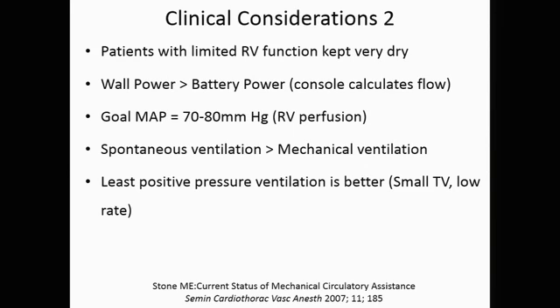Patients with an RV-limited circulation also tend to be kept very, very dry. So when you meet them and feel the urge to give anesthesia to them, it's appropriate to expand their circulating volume. Whenever you can, you should plug their drive console into the wall. That is, wall power is always better than battery power. The wall will not fail you, the battery may.